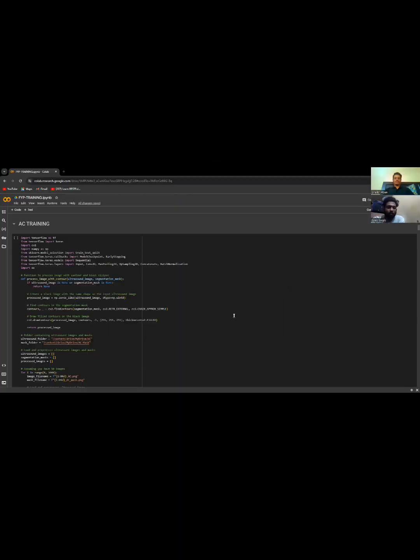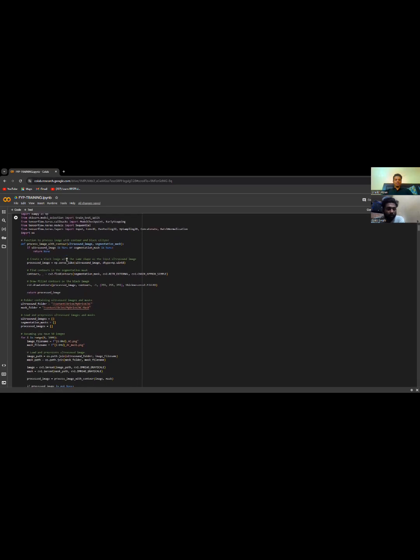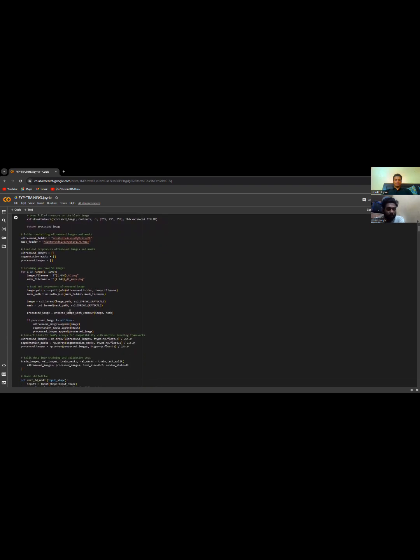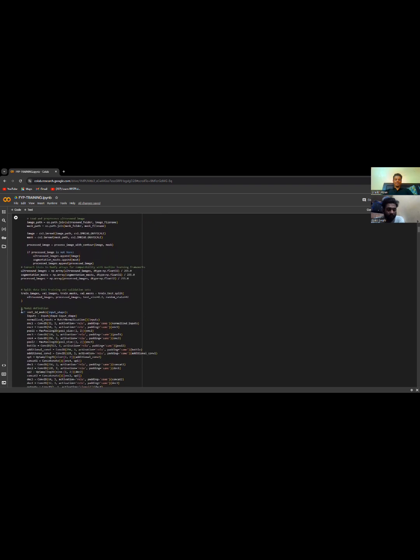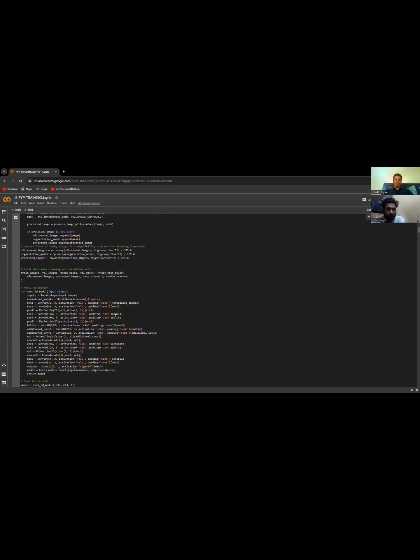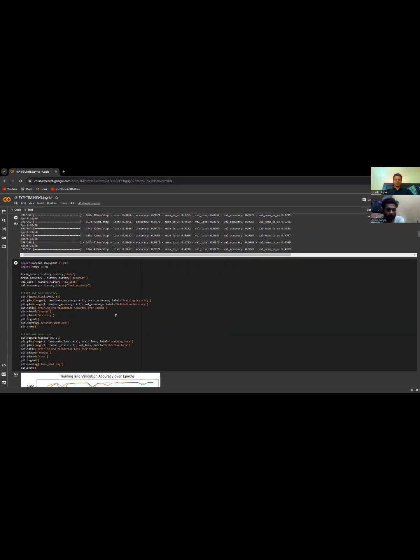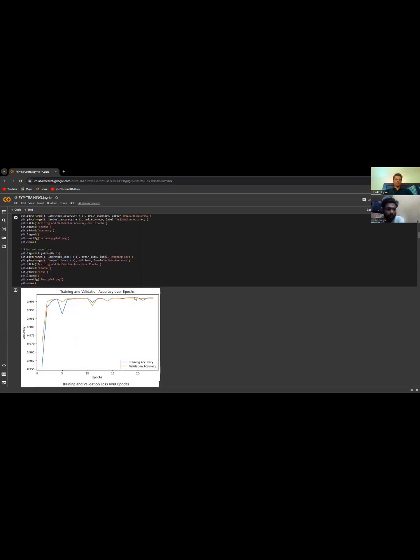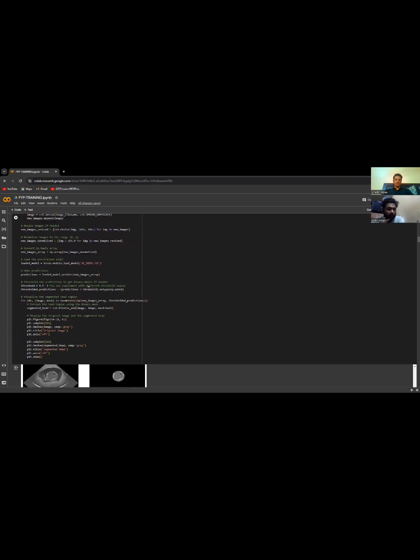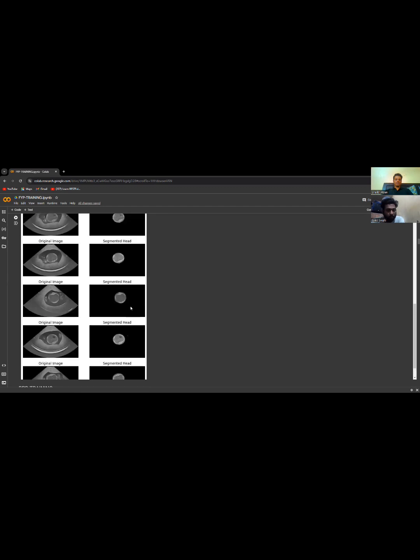So now we would like to demonstrate the functionality. We'll show you how we trained our model, how we trained our four parameters. This is the AC, abdominal circumference, we trained. As we told you, we used the UNet model architecture. These are the layers, and in this section we have described our model. And same as this. Now this is the training and validation accuracy, and that is the testing. We tested this model, and these are the outputs.